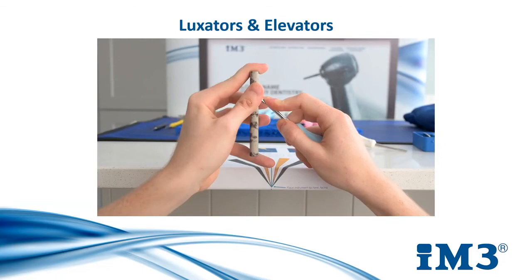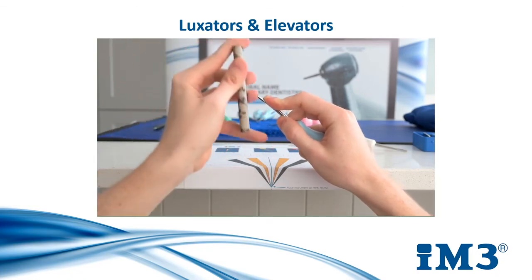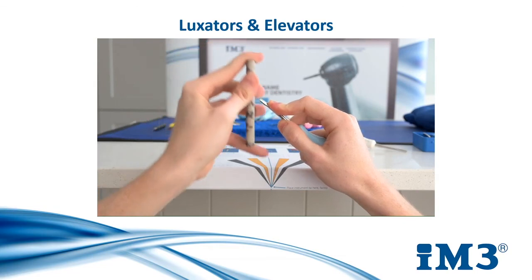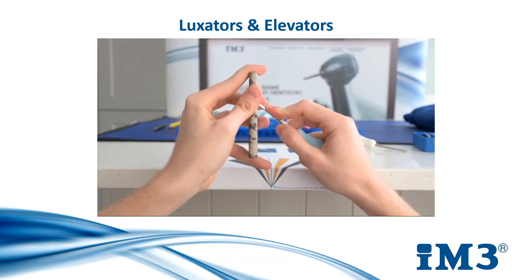As mentioned towards the beginning of this presentation, it is a very good routine to sharpen your instruments after each dental procedure, and luxators and elevators are no different. To sharpen them, you should position the stone at a 45-degree angle as shown on screen. You then move your stone upwards two to three times to successfully sharpen them. You should always finish on an upward stroke.